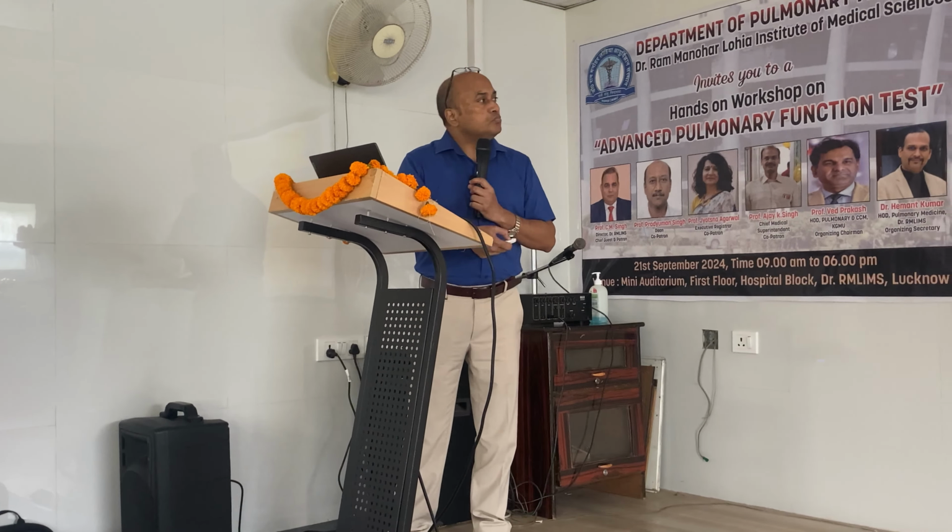There are three types of body box: the pressure type, volume type, and pressure-volume type. The commonly performed body box, what we have in our labs, is mostly the first one, that is the pressure type. Many institutions, it's a costly affair. Many institutions don't have that.